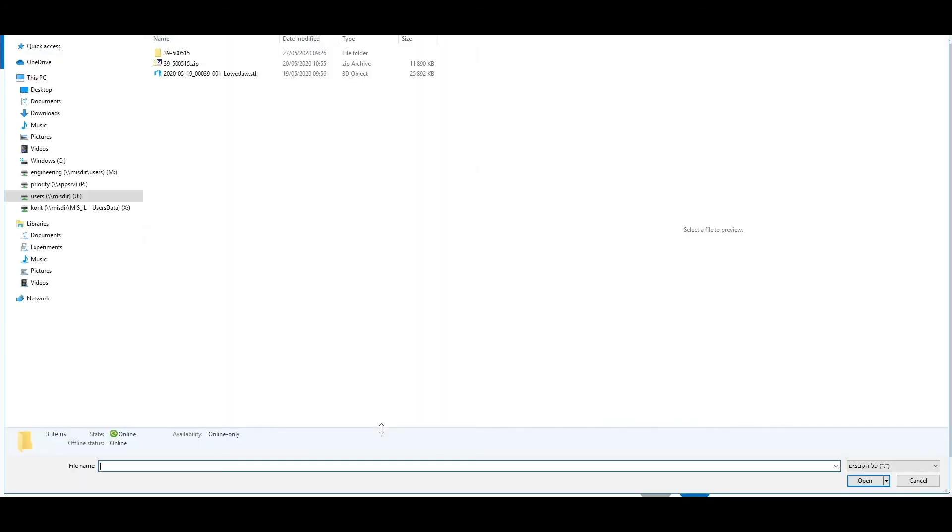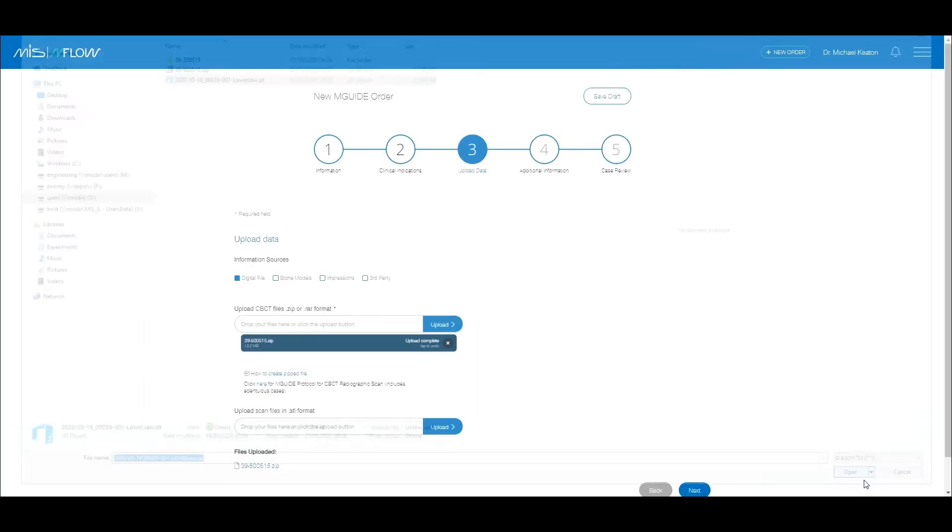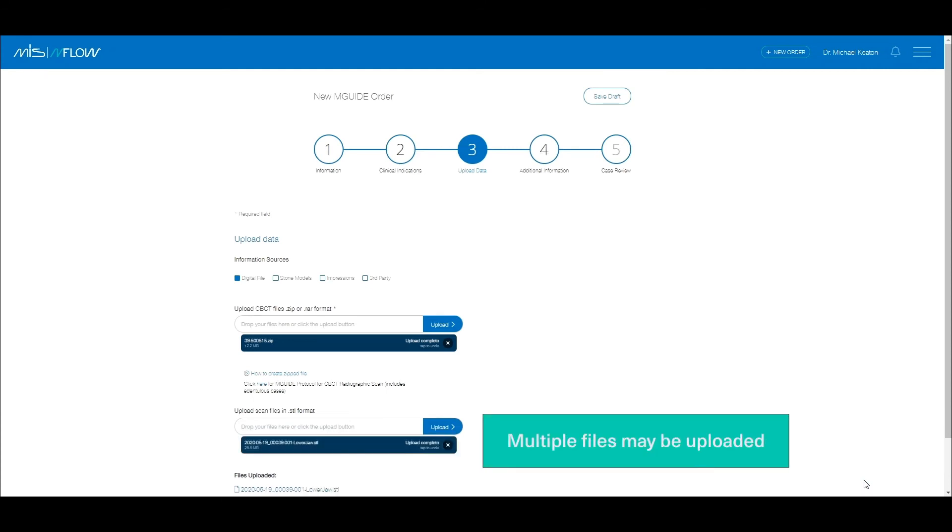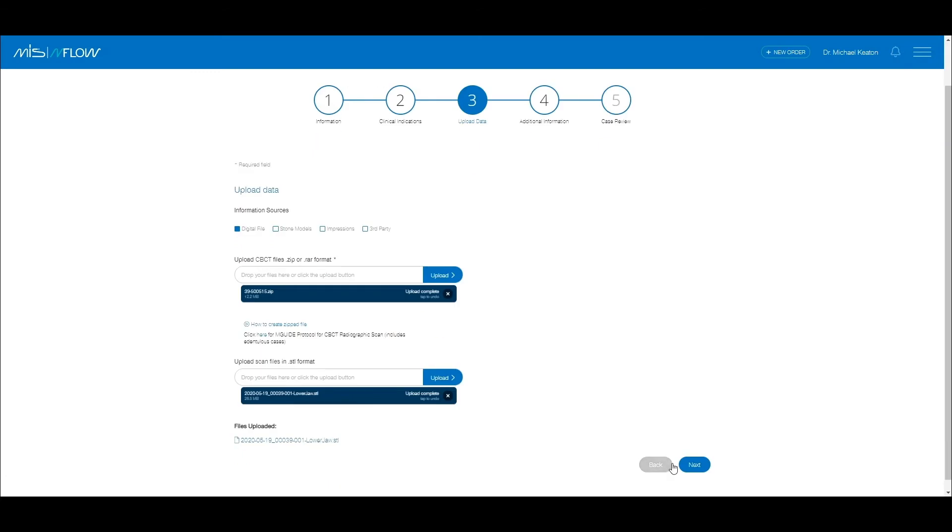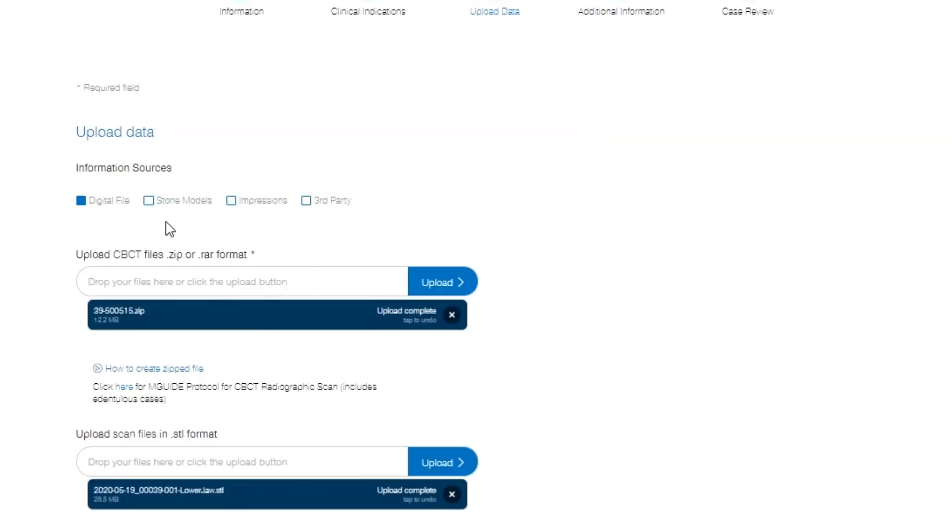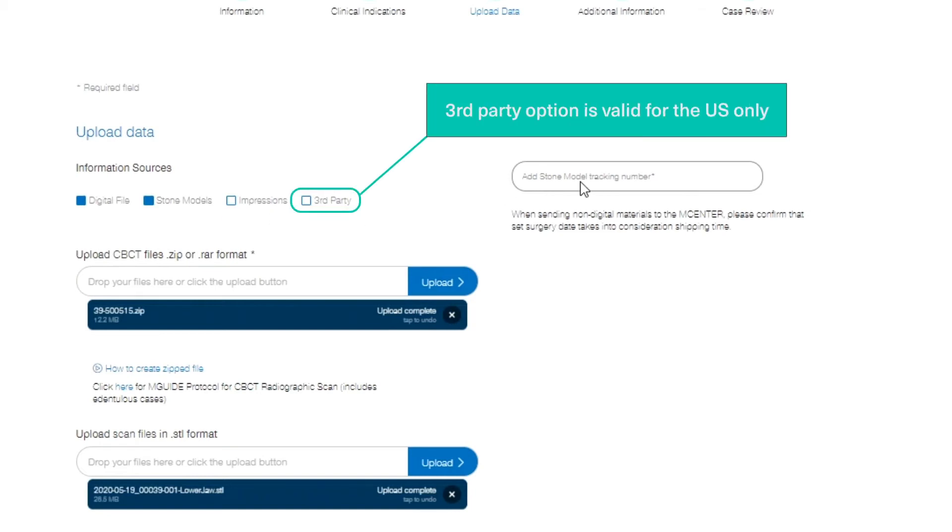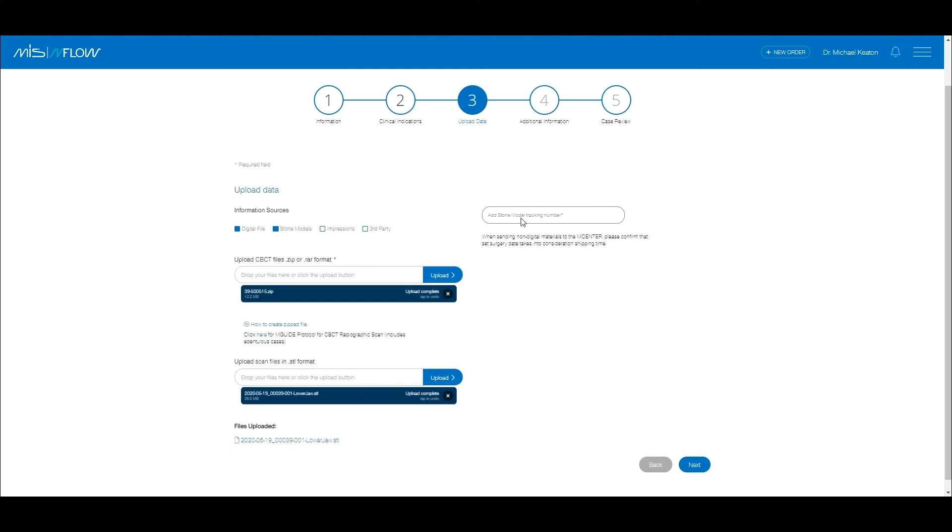Here you do not have to zip the file. If you choose to send the mCenter a stone model for scanning or impressions instead of digital files, check the relevant boxes and complete the tracking number of the shipment. Note that a combination of a digital file and a physical shipment is also possible.